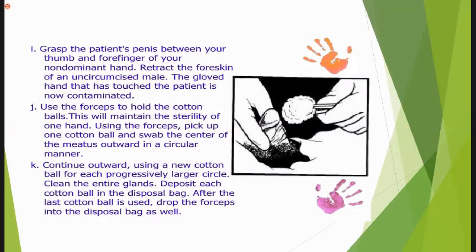Use the forceps to hold the cotton balls. This will maintain the sterility of one hand. The non-dominant hand is now contaminated, and the other hand, with which you hold the cotton balls, is the sterile hand.